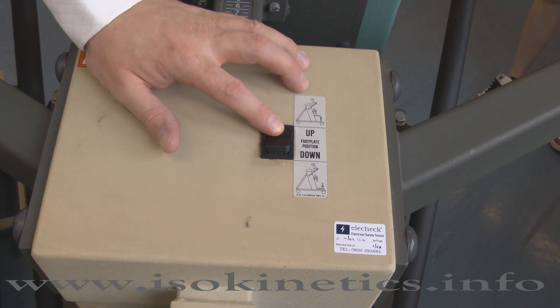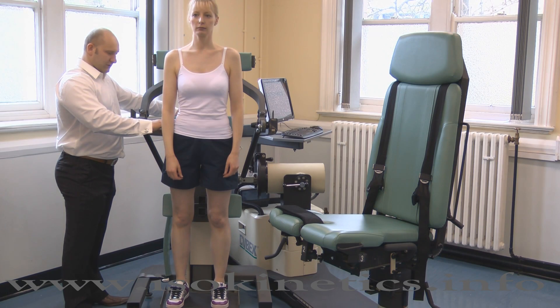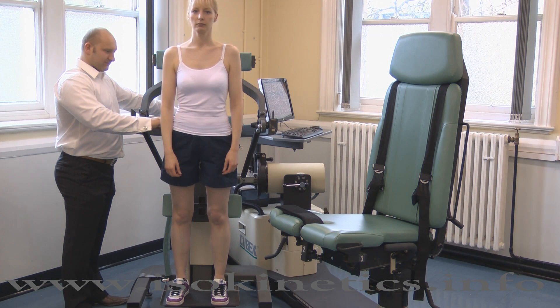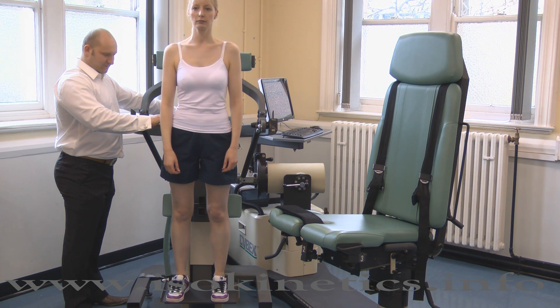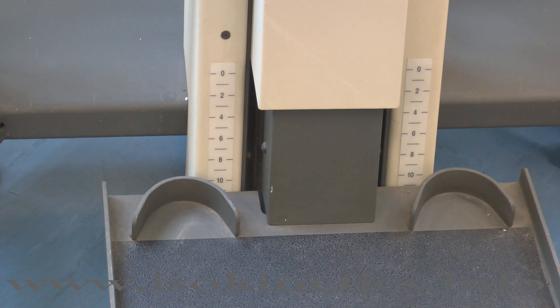Now adjust the height of the foot plate using the switch on the top of the trunk module. Adjust the height until the rubber alignment point is opposite L5-S1. This is normally 1 to 1 and a half inches or 3.5 centimeters below the top of the iliac crest. The height of the foot plate can be seen here.